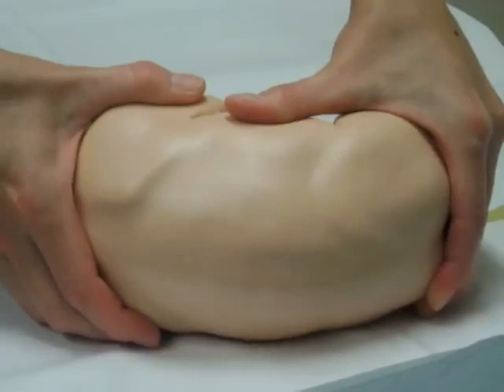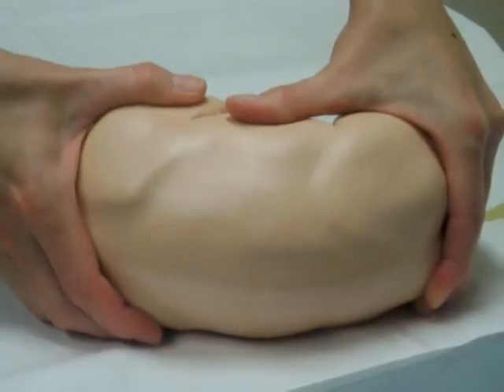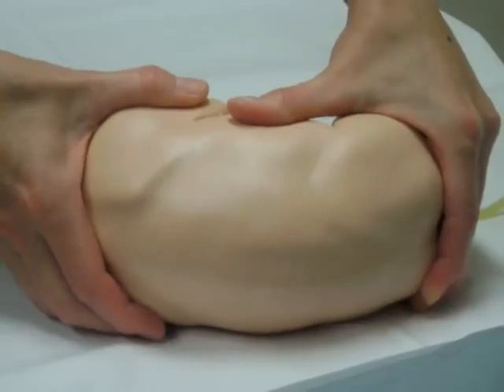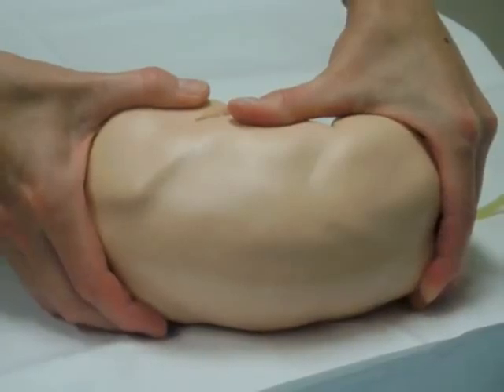Also note, lumbar puncture can be done with the patient sitting up and curled forward. This is more commonly done in older adolescent patients. This is not shown in the video.